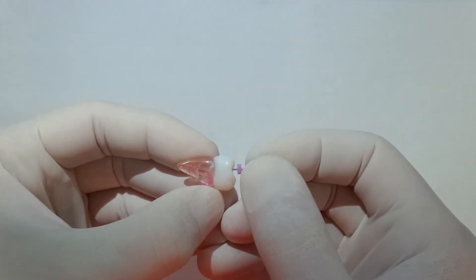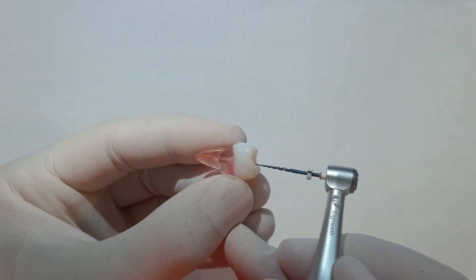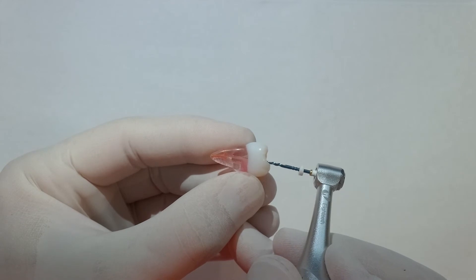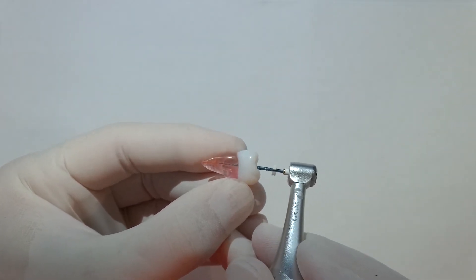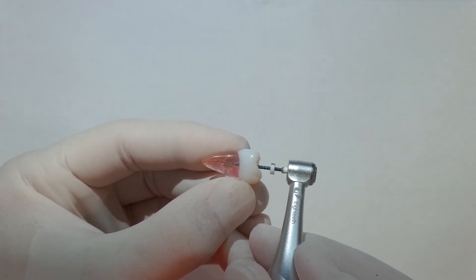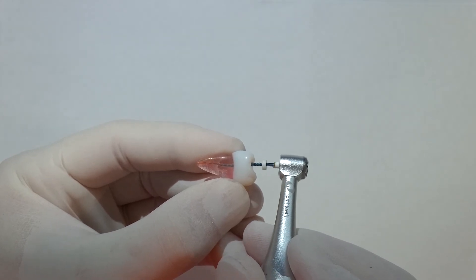Then the next file to go in, the white, the S2. This just does a little bit of preparation, just a little bit further down into the root canal, almost the middle third, just down beyond that coronal third.